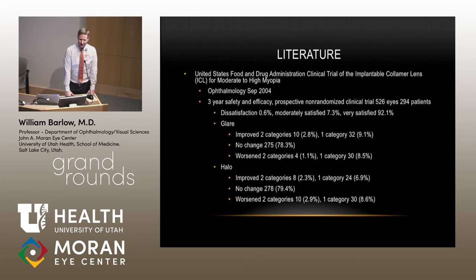Does anybody have any experience that they could share, or thoughts on this specific clinical case regarding his symptoms and treatments that you might suggest that could be helpful? Roger? Have you considered low-dose pilocarpine? You get a bit more pupil restriction than you would have. Haven't considered that yet, but certainly that would be an option. Obviously, we're using Alphagan with a similar thought process behind it, to try and blunt pupil dilation, particularly in mesopic circumstances. But yeah, haven't thought about that just yet.